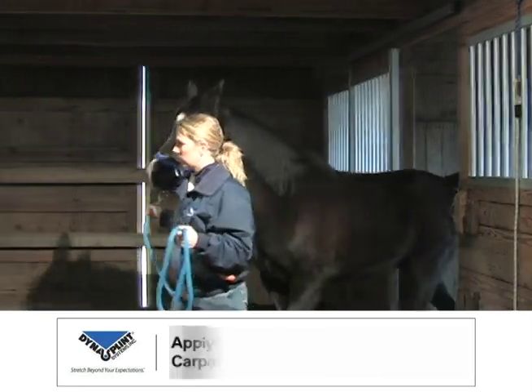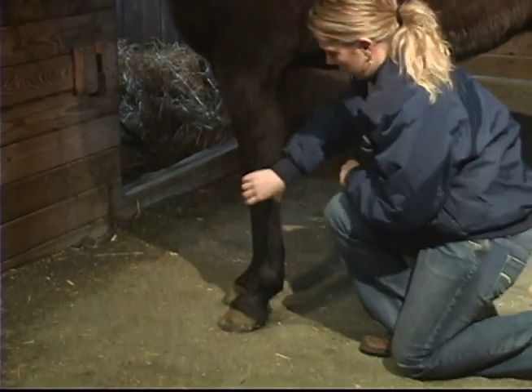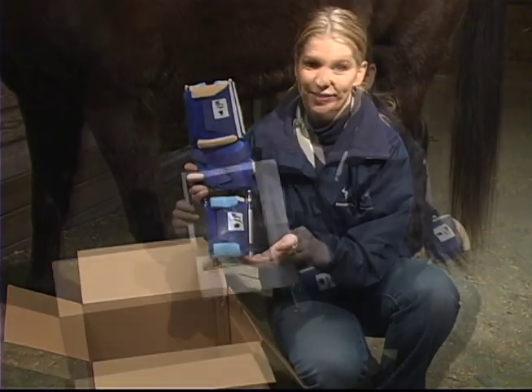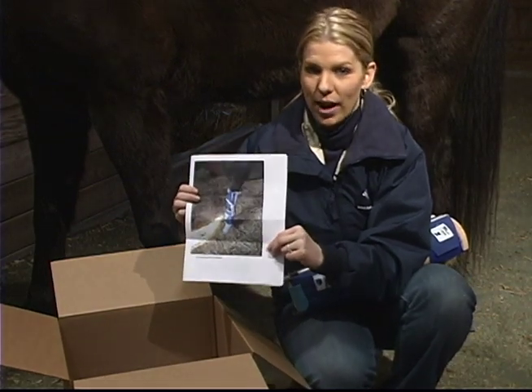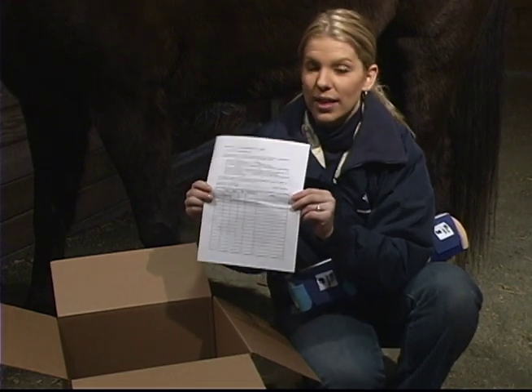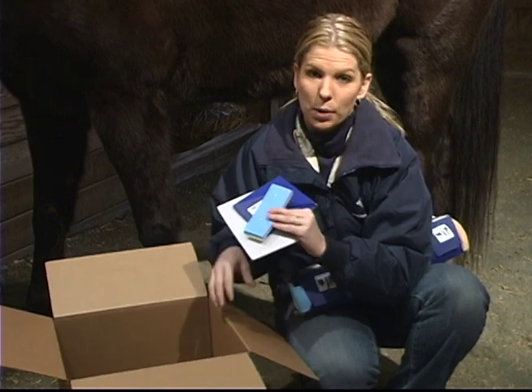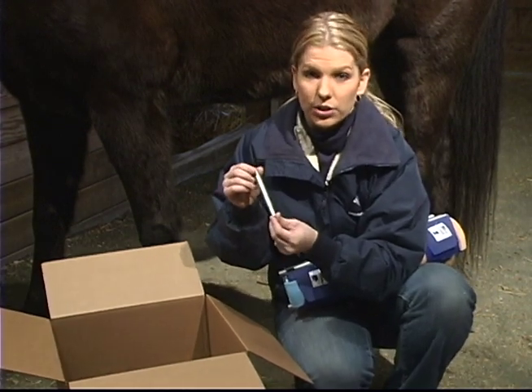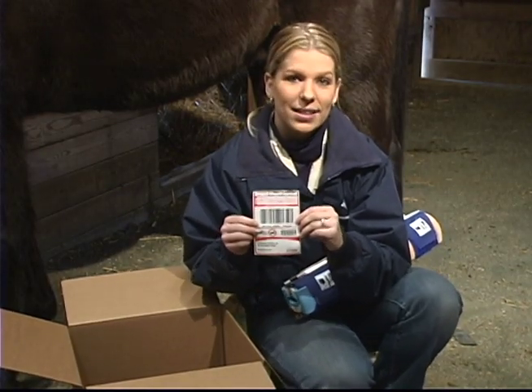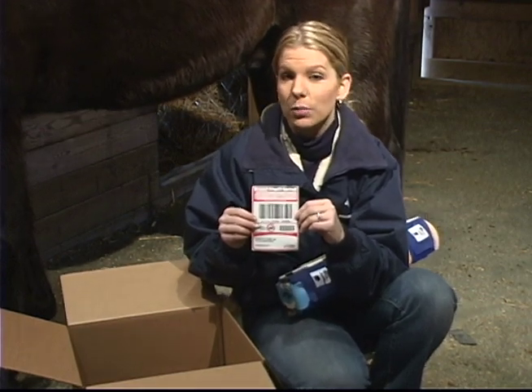The equine carpal varus valgus Dynasplint can be used to treat both varus and valgus deformities of the equine carpus. Your Dynasplint system will arrive fully padded and labeled, ready to apply to the animal. In your box you will find photographs, written fitting instructions, a treatment schedule that your Dynasplint sales consultant has designed specifically for your animal, additional padding necessary throughout the treatment process, a screwdriver used to adjust the tension, and a FedEx prepaid label. Please save this label as well as the box, as you will need them when treatment is complete.